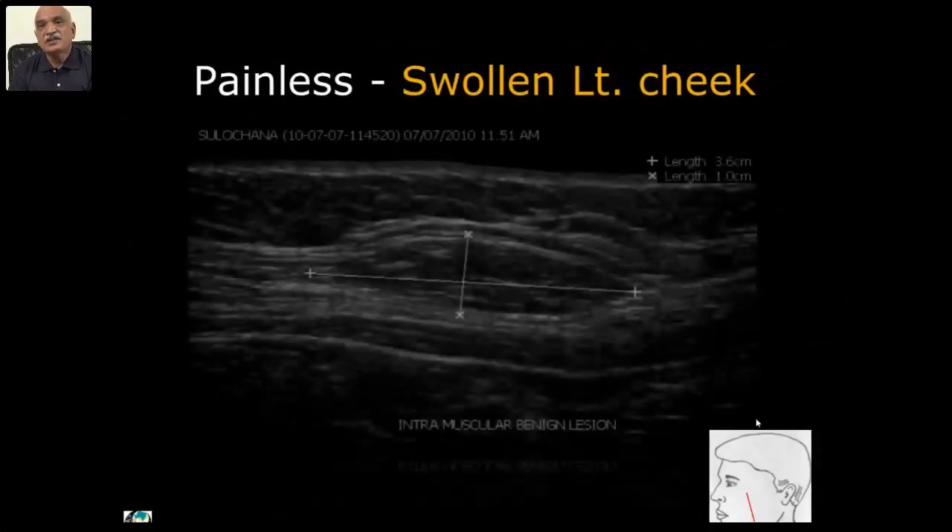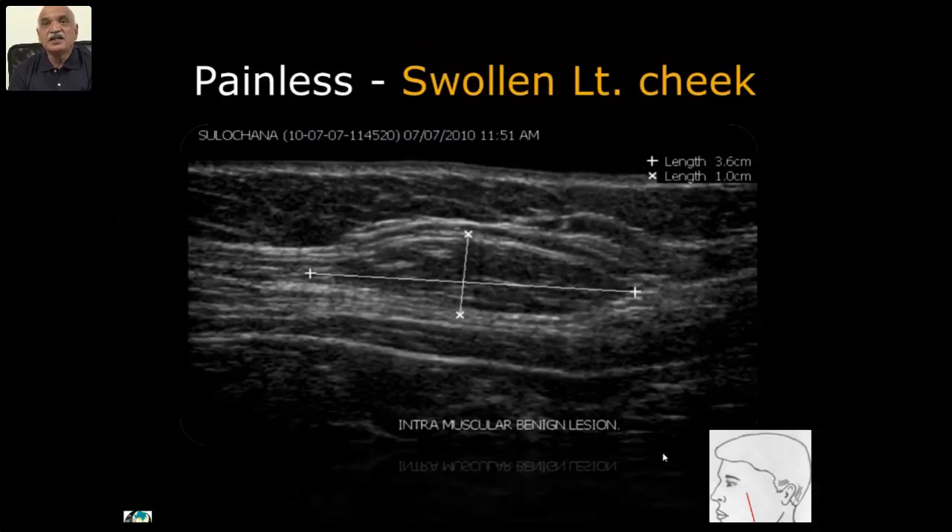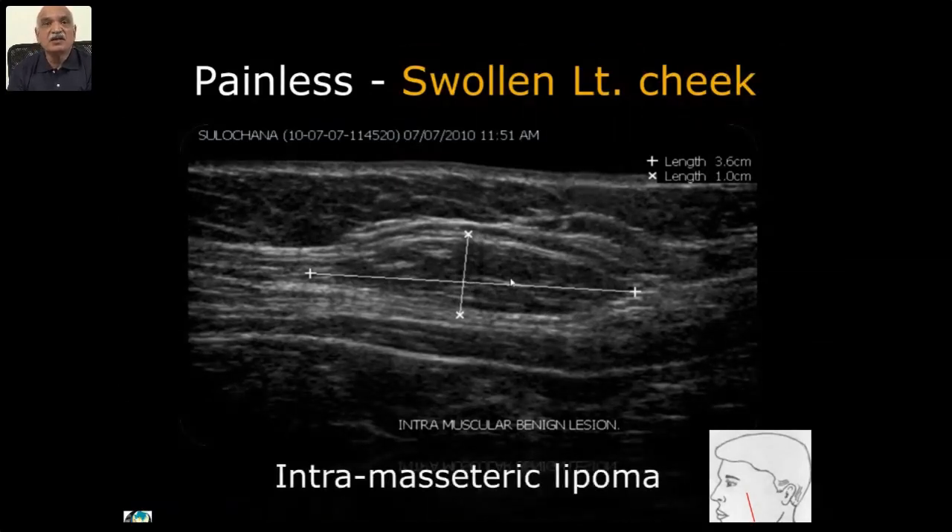Painless swollen left cheek: in the coronal section taken in the masseter region, there is an intra-masseteric benign condition with dense echoic strands within — nothing but an intra-masseteric lipoma, with a well-defined wall.